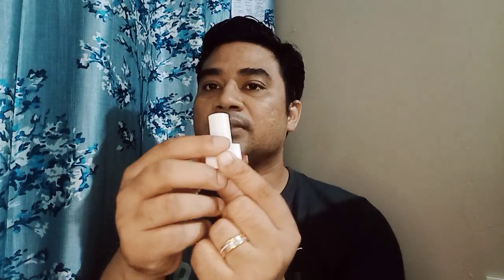Now it's time for demonstration. I've said out the process. Now to demonstrate: I'm holding it with the left hand and pressing two times. You'll get a click sound, two times, very fast. Then shifting to my right hand, I'll hold this and go in half. I'll close my mouth and then inhale, hold my breath, count up to 10, then exhale through my nose.